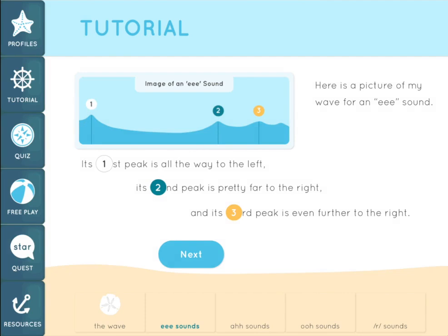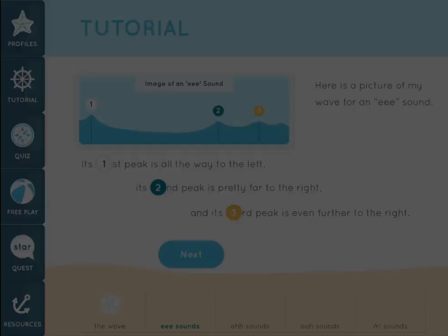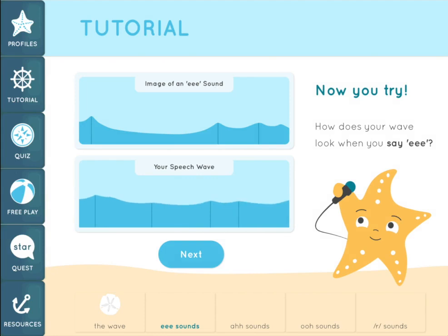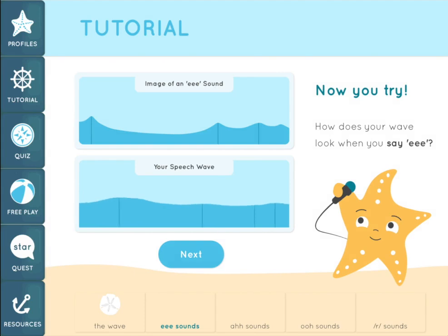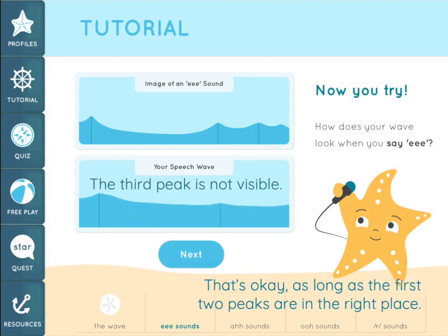Here is a picture of a wave for an EE sound. The first peak is all the way to the left. The second peak is pretty far to the right, and the third peak is even further to the right. Watch me say EE — see how the peaks in the wave on the bottom line up with the peaks in the picture of a wave on the top. Eeeeee.